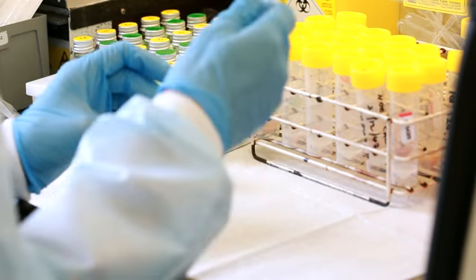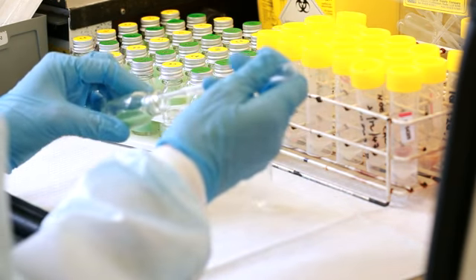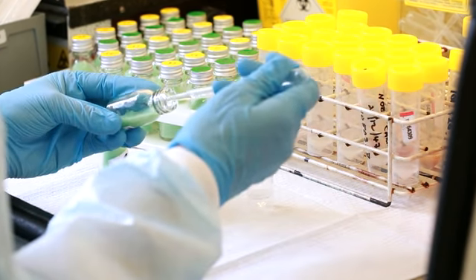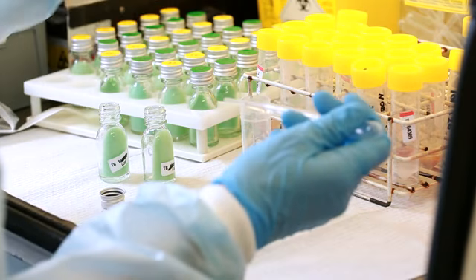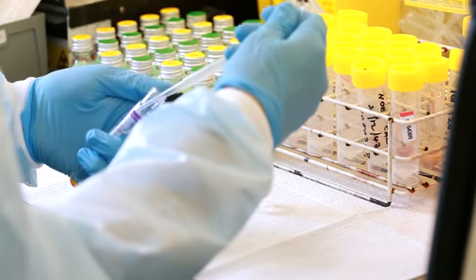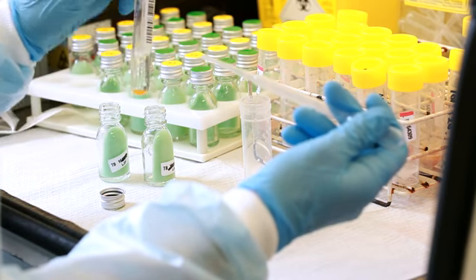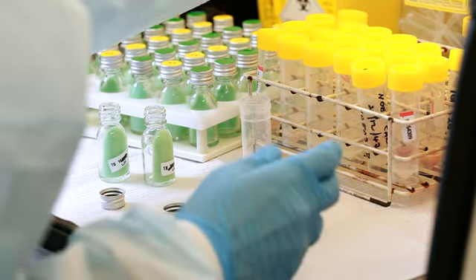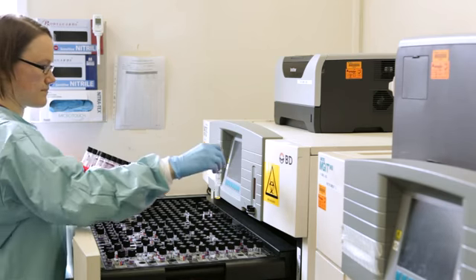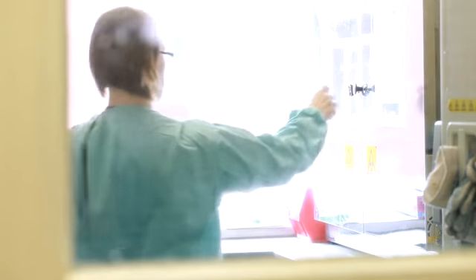The decontaminated samples are centrifuged for 15 minutes and the concentrated samples are cultured into an MGIT tube, liquid culture, and 2 LJ slopes, solid culture. This part of the process takes approximately 1 hour. The MGIT tubes are then incubated in the MGIT instrument for up to 6 weeks. LJ slopes are incubated in a 37-degree incubator for 8 weeks.